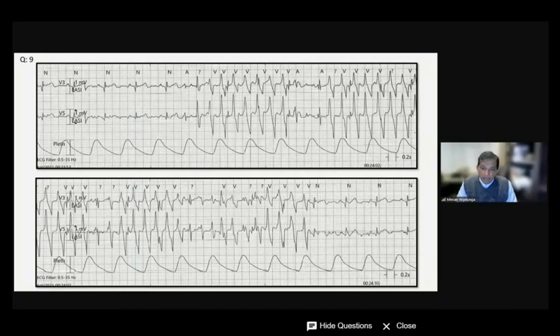And you can put the answers up. Very good, very good. I'm very happy. Most of you understood what it is. So this is a key, because if you don't do that, any of the other three interventions could have happened. So what we have here is a motion artifact of the patient.